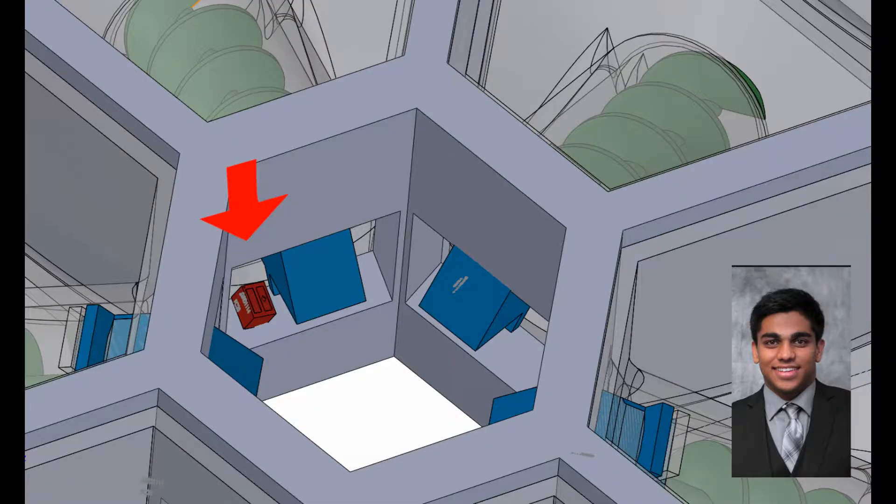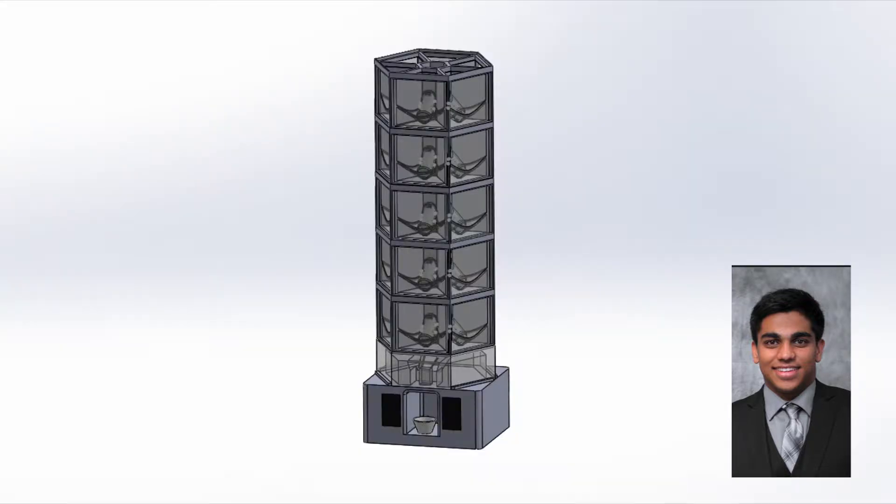There is a tracking system which assigns a unique ID for each of the pills and tracks their usage, comparing it to a predetermined schedule. The sensors track usage statistics so information can be sent to another user such as a family member or a doctor. The product is enclosed to ensure that no pills are taken incorrectly, causing them not to be tracked.